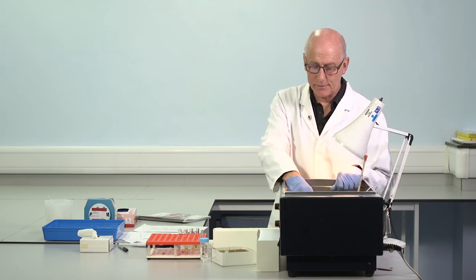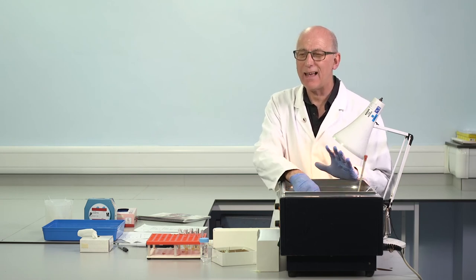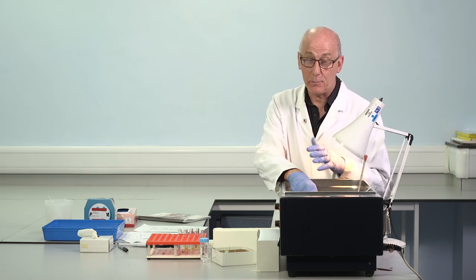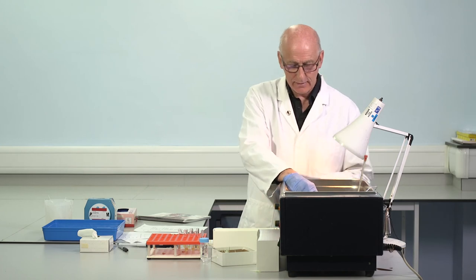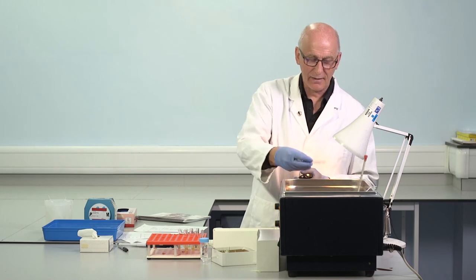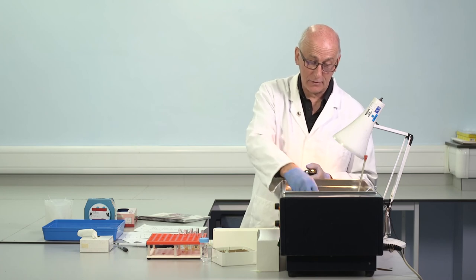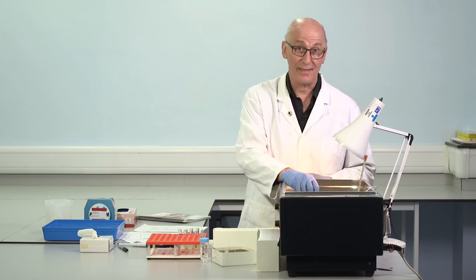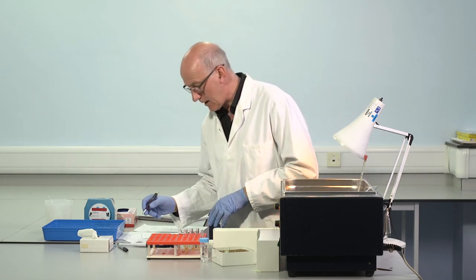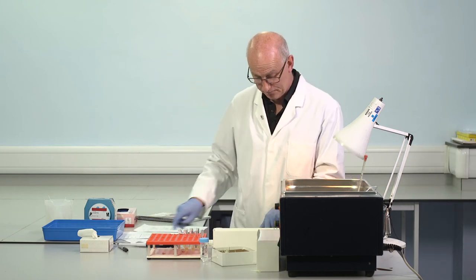Just whilst we're incubating these last few APTTs, the other area that's absolutely important to keep in mind for APTT is pre-analytical variables. It's the way the sample is collected and handled that has a really important impact on APTT. It's the test amongst clotting tests which is most affected by problems in sample collection and processing. Control time 38, 39. So that's a little shorter than the other reagent.